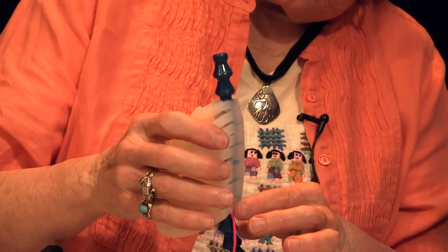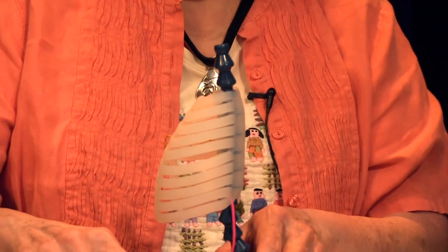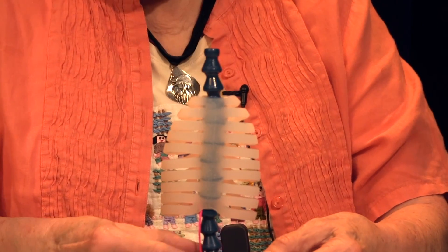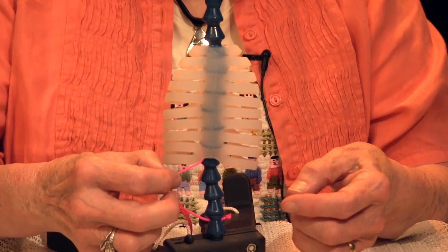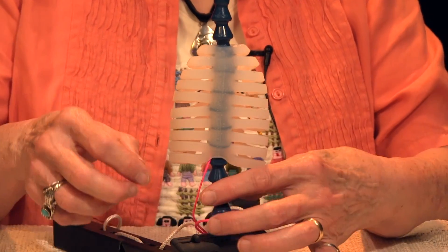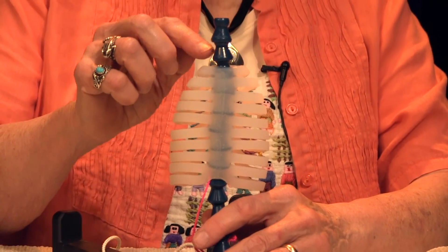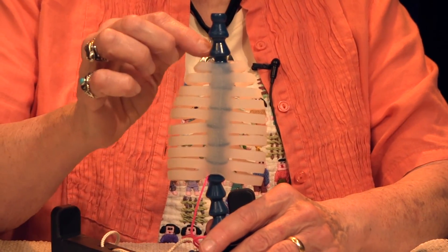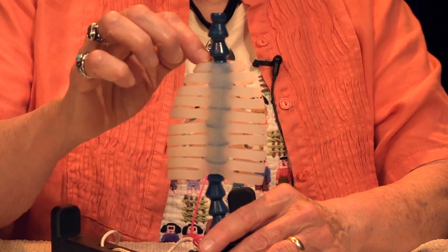At the bottom of the chest, the bead with the pink top cord — the psoas cord attached — will be covered. At the top there will be two beads showing and a space between the second and third bead.